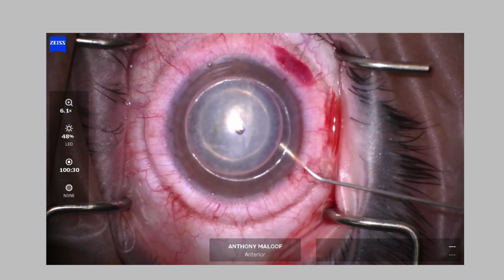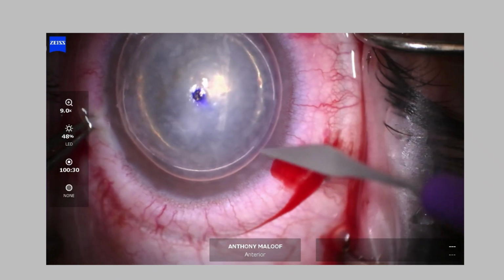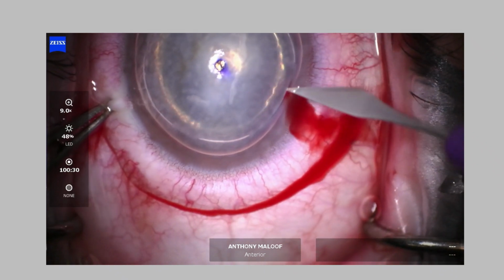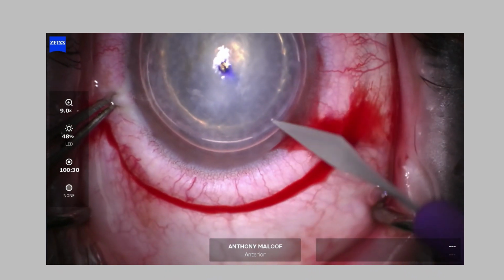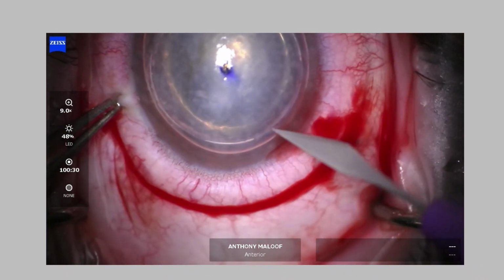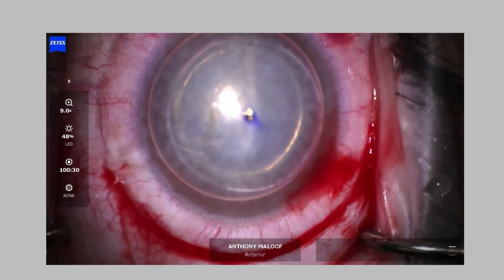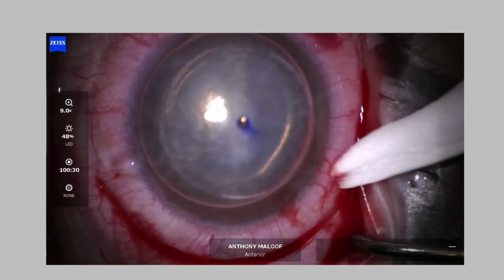Once I do that, then I do a freehand dissection as deeply as I can. It's very tricky to see here because it's actually quite a thin cornea. Macular dystrophy corneas are quite thin. They're also very rigid. You'll see that the dystrophy extends not just through the stroma but into Descemet's. So there's always going to be a little compromise, but I think the price of keeping the endothelium is worth it. Once I get there, watch how I struggle with the initial dissection down to Descemet's membrane.